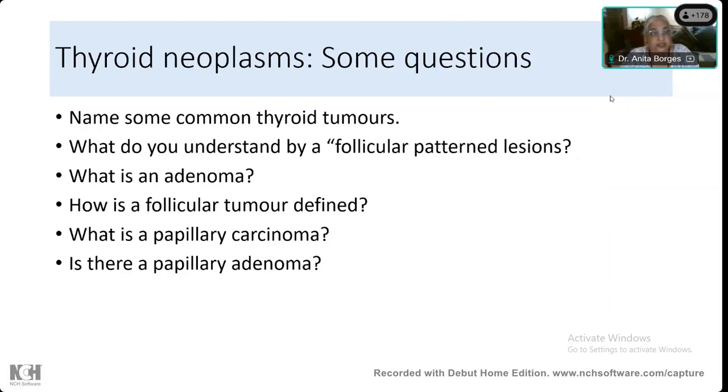All right, let us come back to the thyroid. But what I wanted you people to understand is that you think a follicle is always hollow or a ring. It is not a two-dimensional structure like a ring. It's a three-dimensional structure. So even a thyroid follicle is a sphere. It's a rounded structure which is hollow. And in that hollow, what is there?